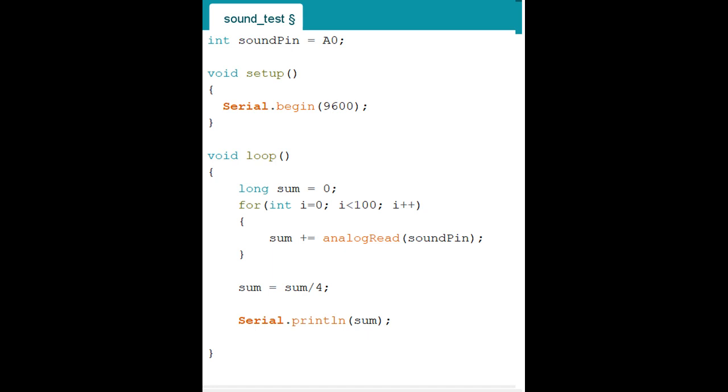We use i a lot for the condition for the loop, because i is an integer. So i equals 0. I'm giving you i again, assigned a number, right? i begins from 0, and then a semicolon. I'm done with the first condition, and then i is less than 100. So if i reaches 100 or more, nothing happens. Don't do anything. Okay, so i is less than 100, a semicolon, and then i plus plus.